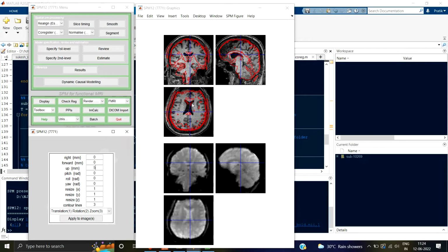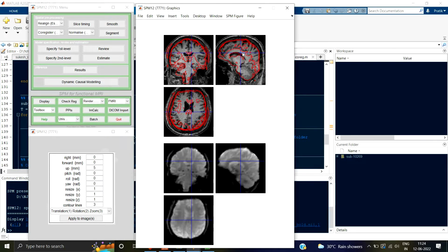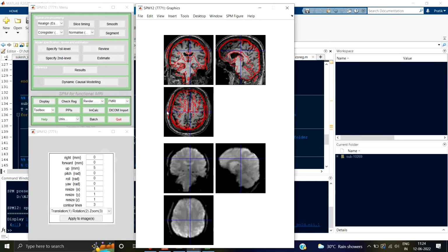You can see these things are also now nicely aligned. This is nicely aligned. You can see this is also very nicely aligned now, and just have a look at the other slices as well. So this is one way you can correct the co-registration. I would recommend, if you have a small number of images, say 10 or 20 images, do this manually. After every co-registration step, you should check the co-registration output and manually tweak it by using reorient, so that you make sure that the co-registration is perfect.